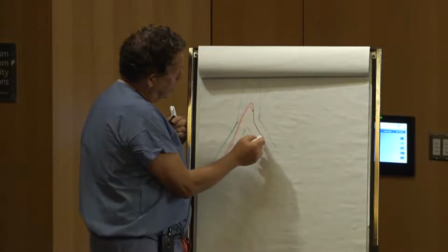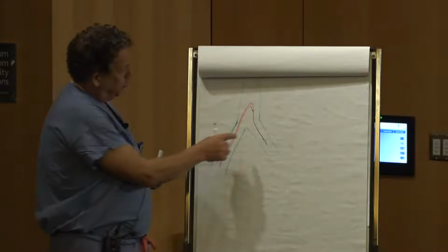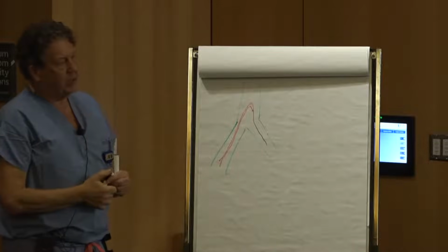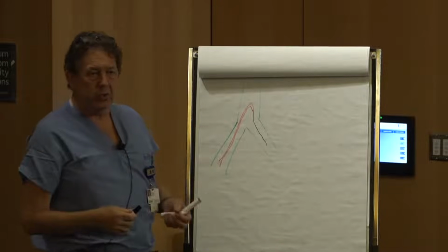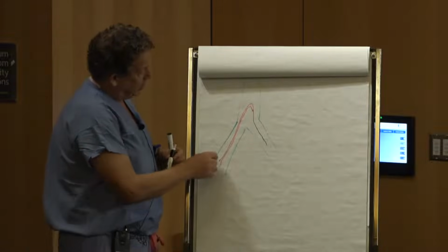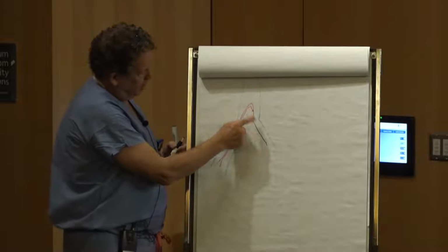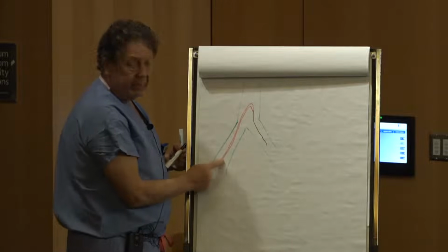So when you get a wire down like that, now it's not down very far, is the problem. When you push that wire, it pushes the catheter up. And so what Dr. Wright was talking about is engaging the bifurcation. Again, these are words that we're so used to using, I really have no idea if you know what we're talking about some of the time. What you want is for that catheter to be sitting right there, okay? And if you leave the wire here and pull the catheter, then the whole thing basically will come out.